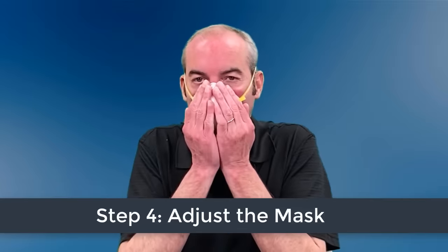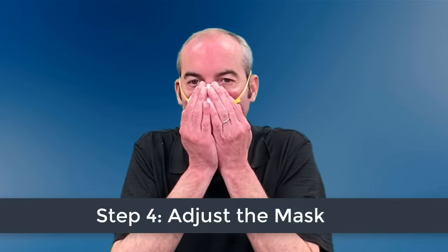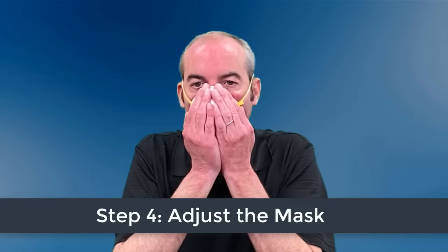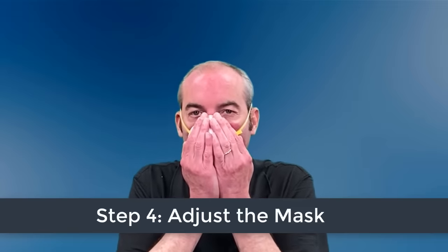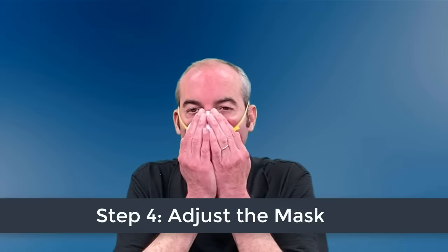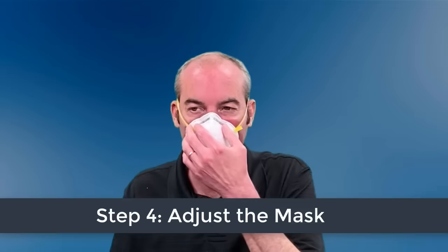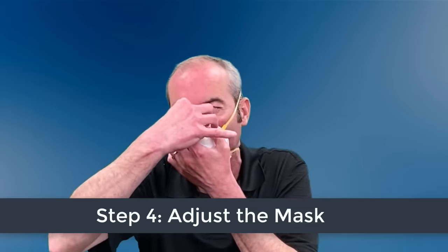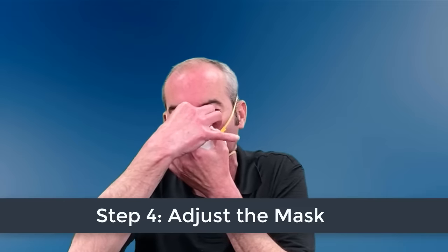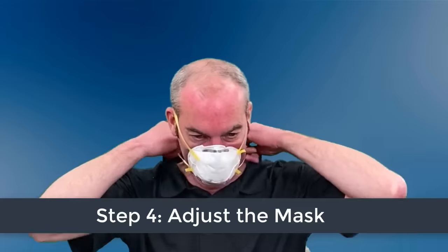Now you need to check for a proper seal. Place both hands over the mask and take a quick breath in to check whether the respirator seals tightly to your face. Keep both hands completely over the respirator and exhale. If you feel leakage, there is not a proper seal. If air leaks around your nose, you need to readjust the nose piece. If air leaks at the mask edges, readjust the straps along the sides of your head. Take these steps until you get a proper seal.